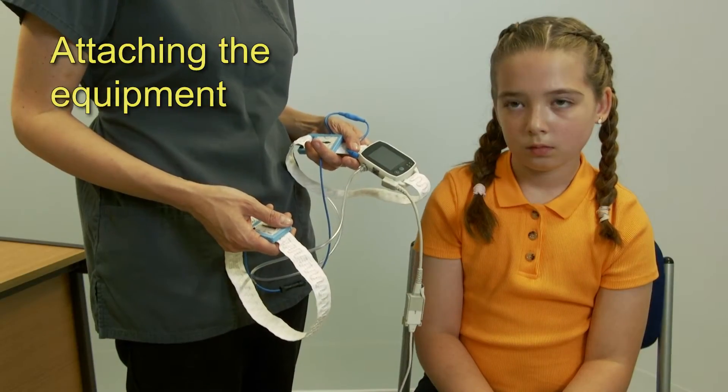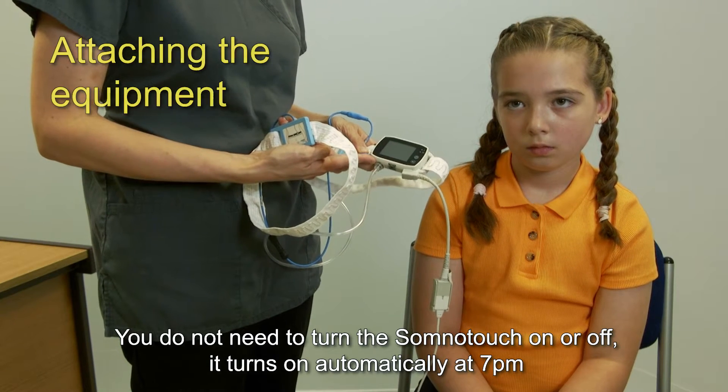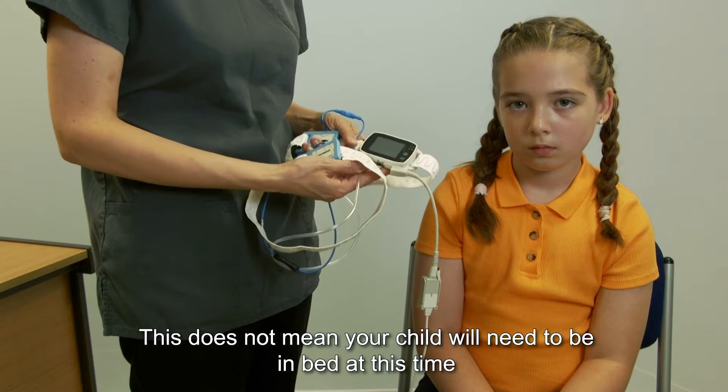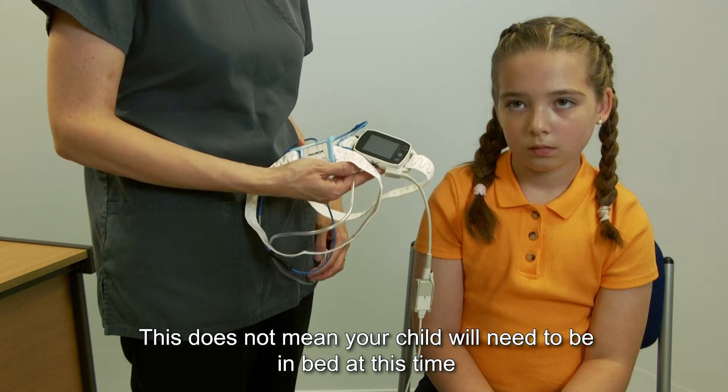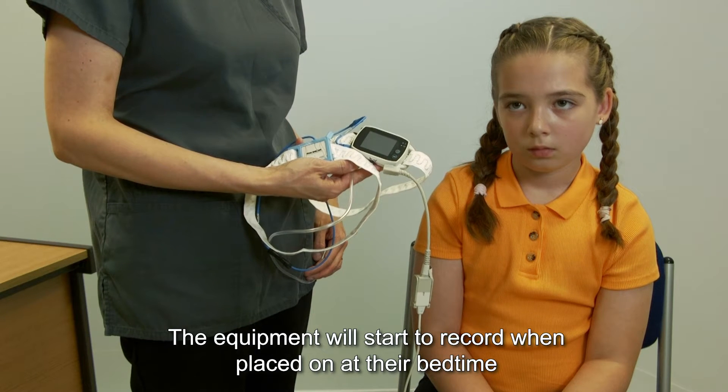Attaching the equipment: you do not need to turn on the SomnoTouch — it turns on automatically at 7pm. This does not mean that your child will need to be in bed at this time; the equipment will start to record when placed on at their bedtime.